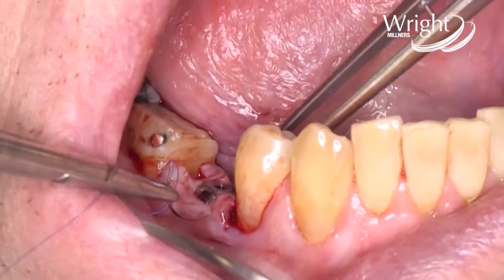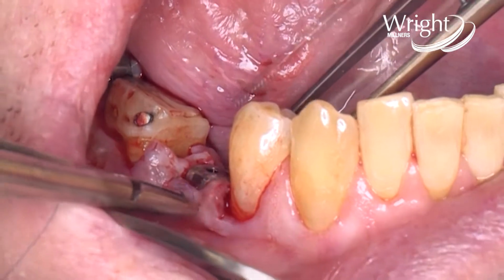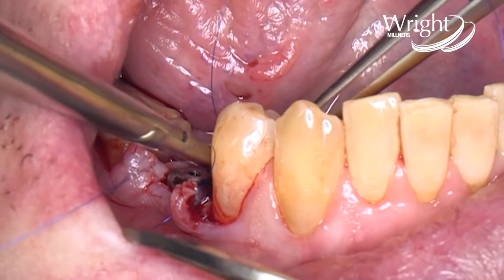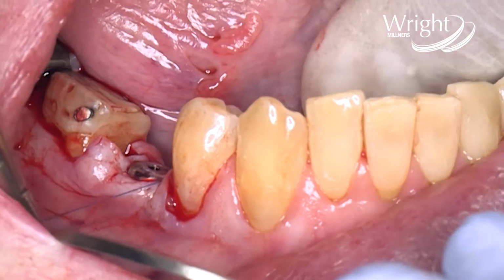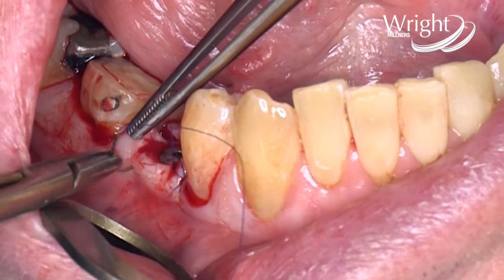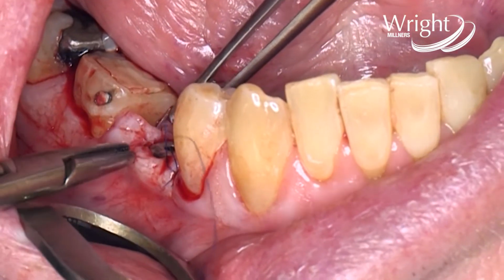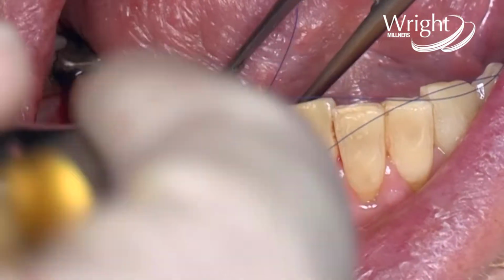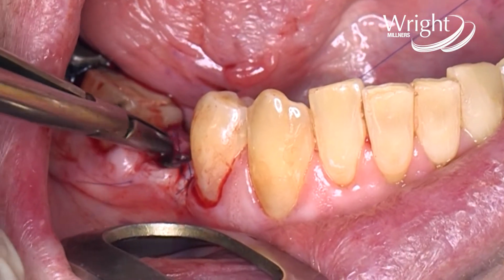And then we use our 6-0 non-resorbable monofilament sutures because we're wanting to reduce the inflammation and we don't want to strangulate the tissue. So we go through the first thing, always grabbing in the middle of the shaft of the needle, not at the swage or at the tip. Go through the one part of the tissue first, the buccal part of the flap. Don't try and go through all the way. Then engage the second part.